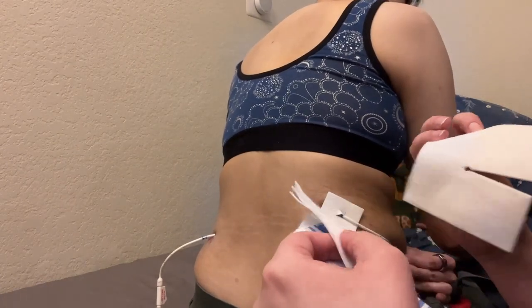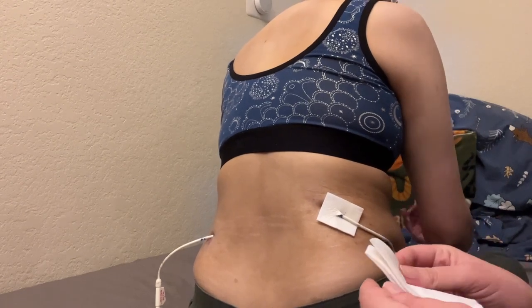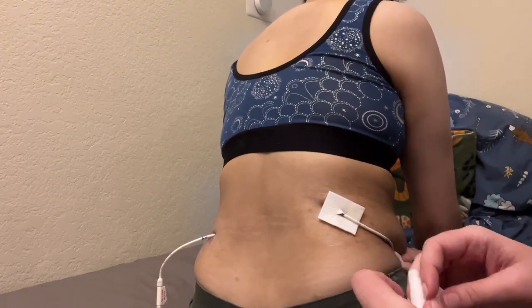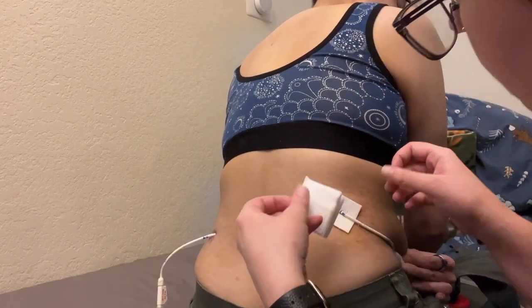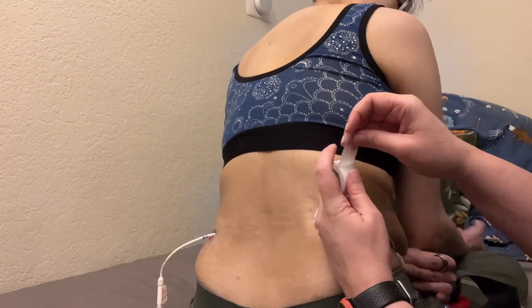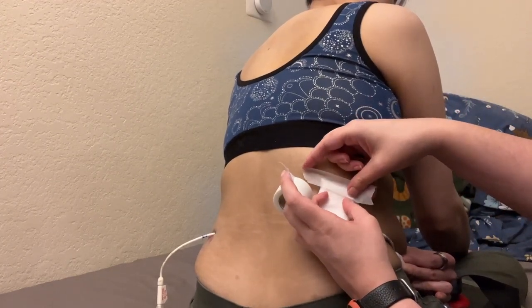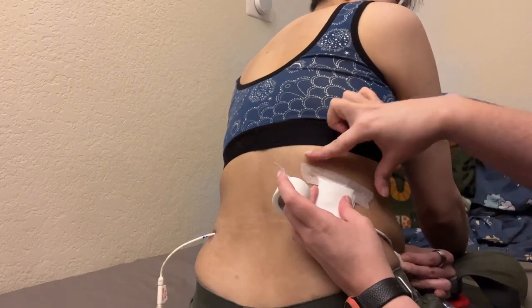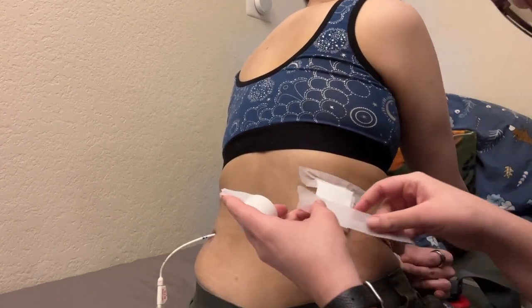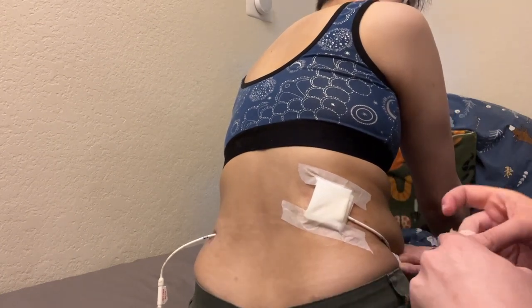I don't have a lot of leakage from my stoma now. When I first got it, it would leak urine a lot, and I wanted gauze or something absorbent to soak it up and keep it away from my skin. Now that the stoma has settled, it rarely leaks. But the other thing is, like I said, I'm very active. What the gauze gives me now is cushioning — so that when I have something on my back or I'm lying on a floor to do exercises, there's something soft between my stoma and whatever I'm hitting it on, making it more comfortable.